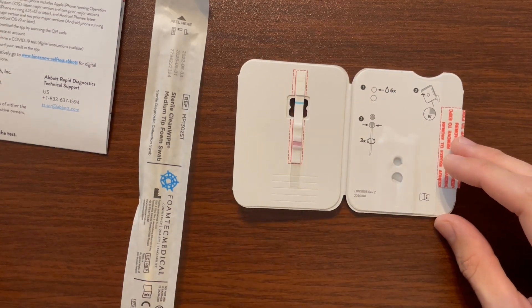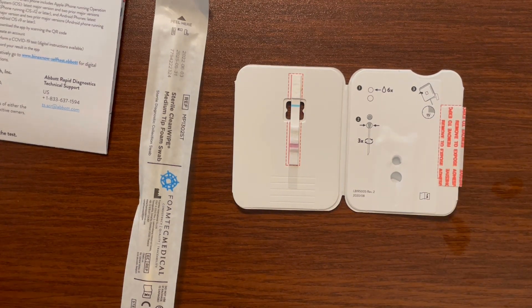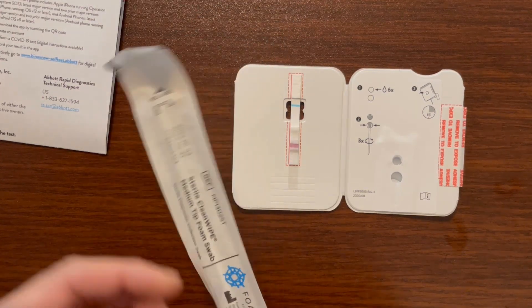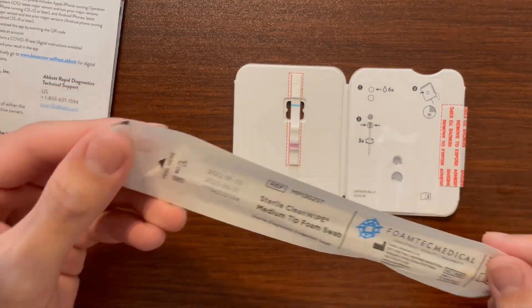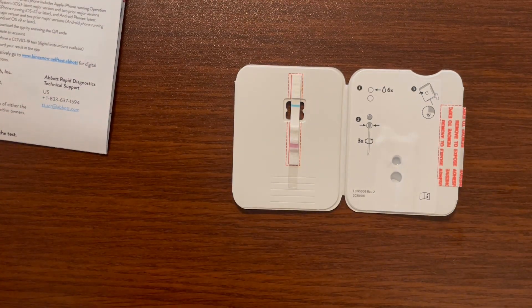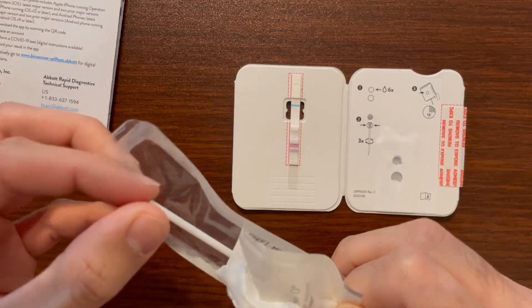Make sure you got the six drops in there and then go ahead and find your swab. Find the end that says peel here, that's going to be away from the tip. Go ahead and open that and take out the swab from this end.